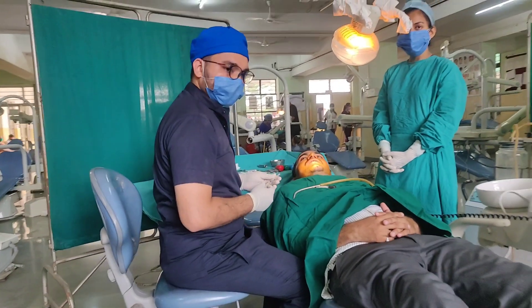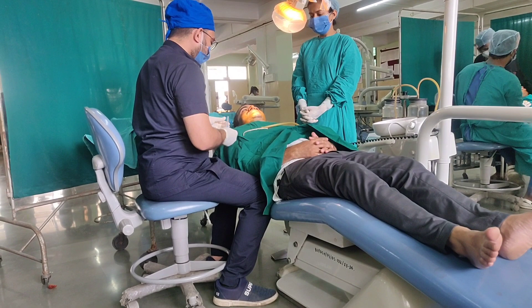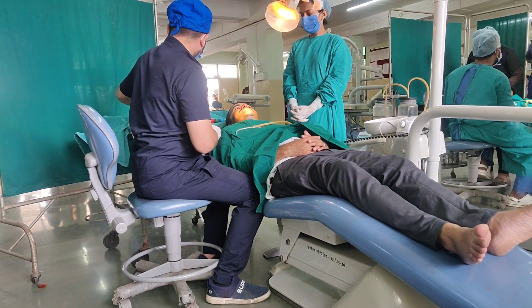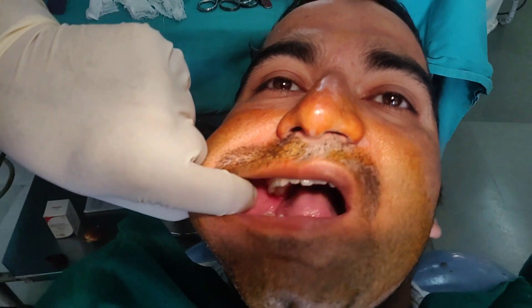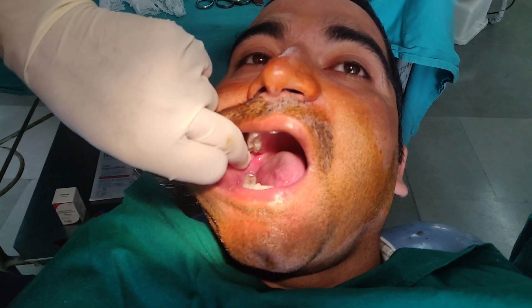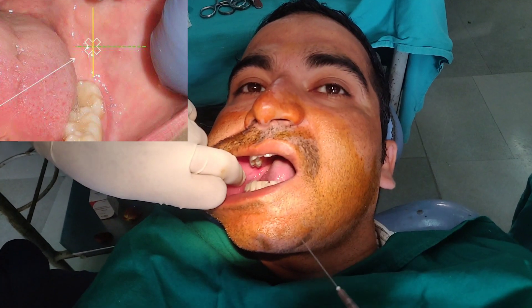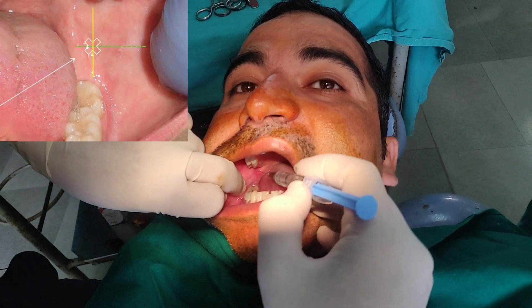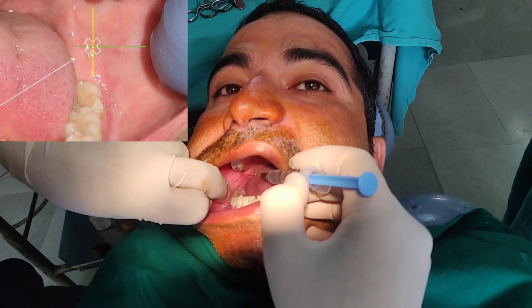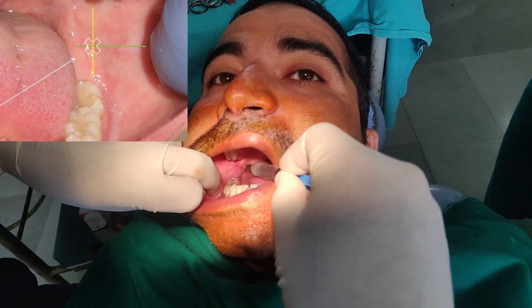Now observe the patient and operator position. It is the 8 o'clock position because he is going to extract tooth 8. First, palpate the retromolar fossa, then retract the cheek and observe your injection site. Place the index finger of the same hand externally over the ramus of the mandible, then visualize the pterygomandibular triangle — one horizontal and one vertical line as shown in the picture.